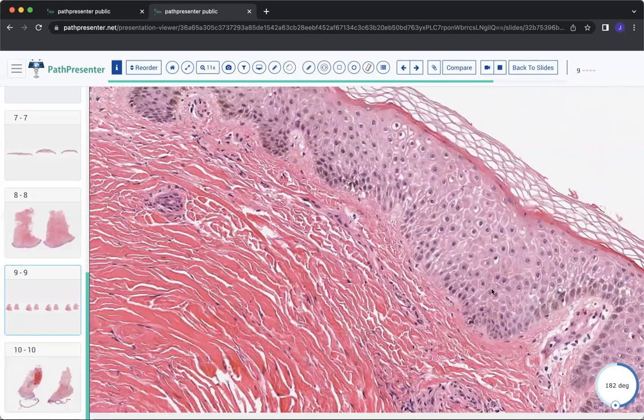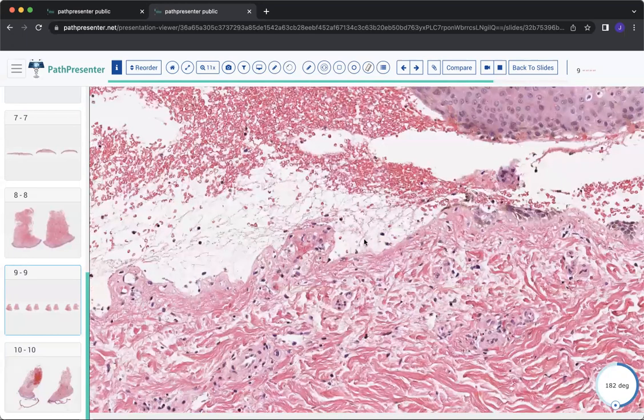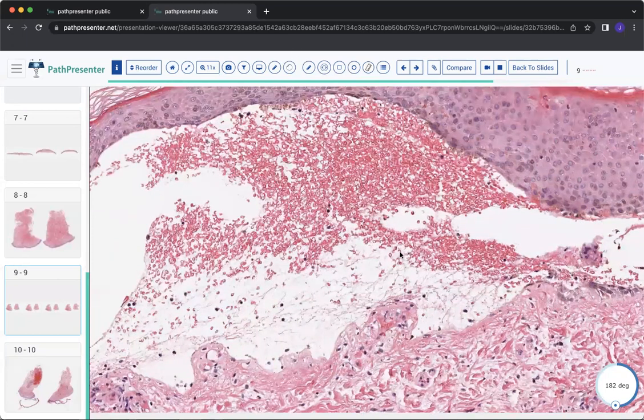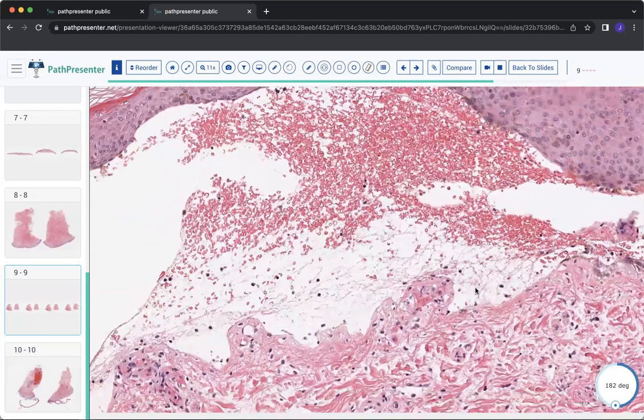So in real life, though, over here, the collagen 7 was attacked already. This is not salt split skin. This is pathologic split skin. So this is going to have type 7 collagen already attacked, and so it's gone here, basically. It's degenerated. It's not around, right?